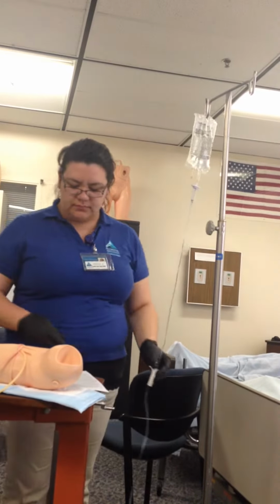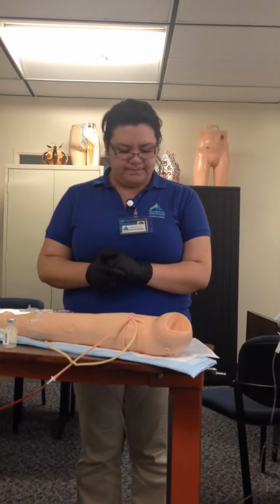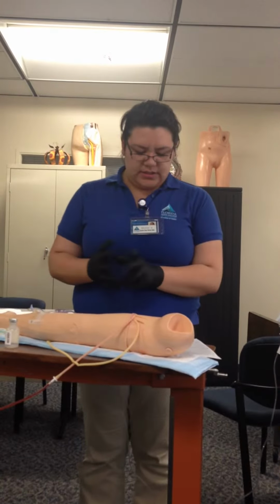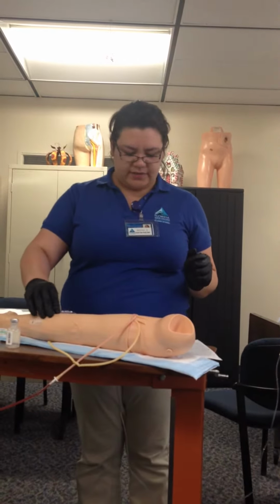Okay. So I'm going to observe the infusion periodically until it's complete. I'm going to wash my hands and take off my gloves using aseptic technique. And just observe for signs and symptoms of any adverse reactions.